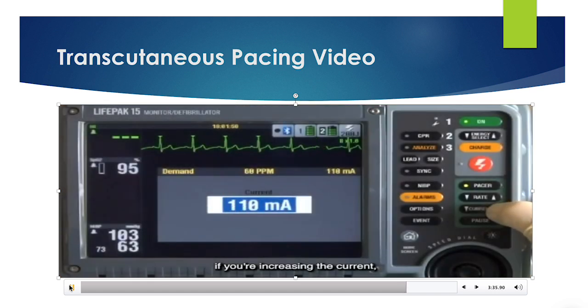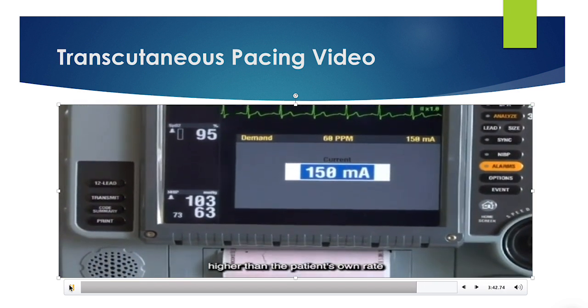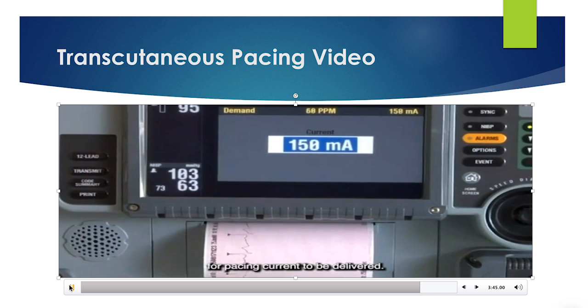If you're increasing the current, but the patient is not twitching, check the patient's heart rate. Remember that the pacing rate needs to be set higher than the patient's own rate for pacing current to be delivered.